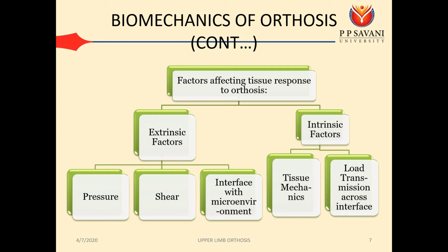Extrinsic factor: once you have applied the orthosis, externally, is there any pressure? Is there any shear? Or is there any interface with the microenvironment between the orthosis and the part that you have aimed to treat with the orthosis? So, is there any interface with them? Is there any pressure or is there any shear? This will be all the extrinsic factor from the environment to the body part you have given orthosis to.